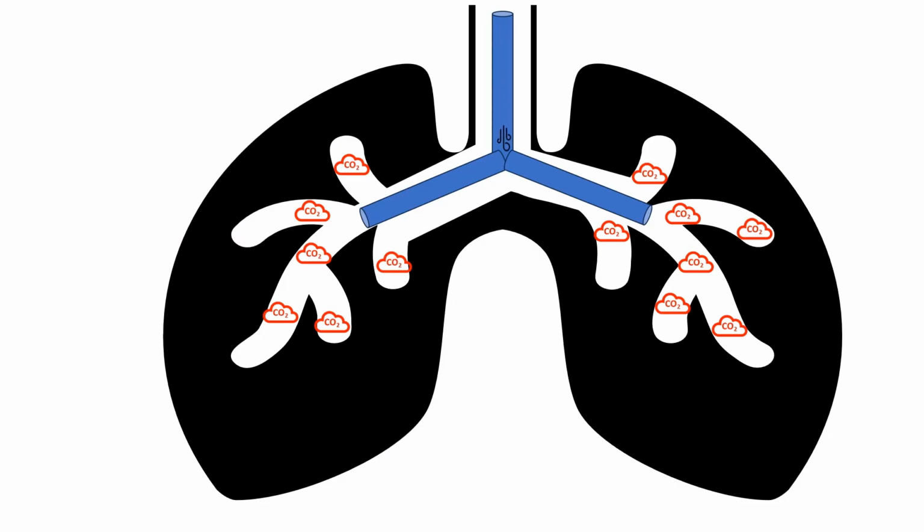As the high-speed jet pulses enter the lungs, they form an air stream in the center of the tube. The air streams penetrate the dead space instead of pushing it further down into the airway. The penetration causes the dead space and carbon dioxide to move to the outside of the gas stream and against the airway wall. The dead space and carbon dioxide are passively exhaled in a bidirectional double helix pattern. Since the tidal volume is less than anatomical dead space, the impact of dead space on ventilation is minimized since it is continuously flushed out.